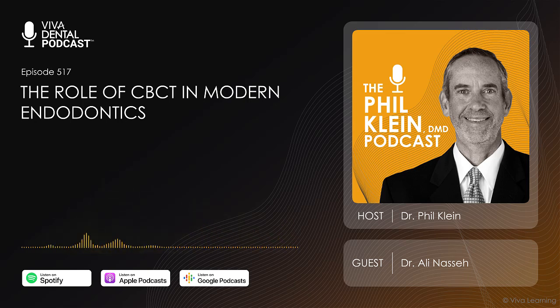through your CBCT analysis. You determine the location: is it on the buccal or on the lingual, is it surgically accessible? Then that'll help you decide whether this is one of those teeth where you're going to have to actually treat either non-surgically and observe, or non-surgically and surgically combined based on the classification. Or is it a tooth that you should just kind of watch and let it ride into the sunset until it becomes a problem that has to be extracted? Because some of these cases, if you actually jump in there and start to do treatment, you can expedite and cause an infection of that resorptive defect, and that's going to expedite tooth loss, whereas the resorptive defect could otherwise stay in place and slowly grow over time.